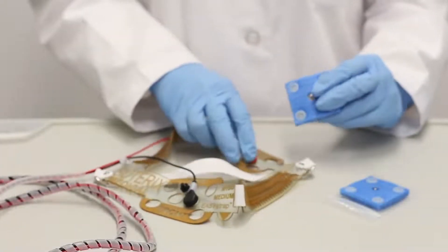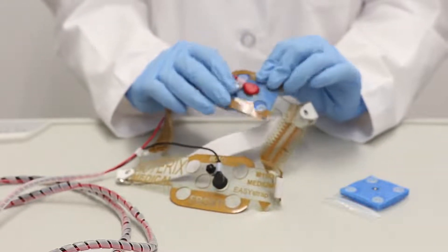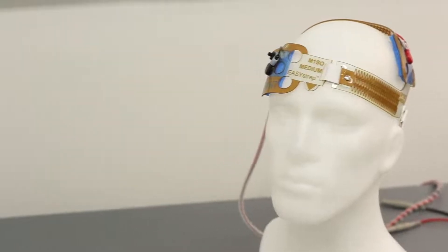This process is optimized by using a specialized headgear and a pre-saturated snap connector electrode. For each montage, there is a specific headgear.